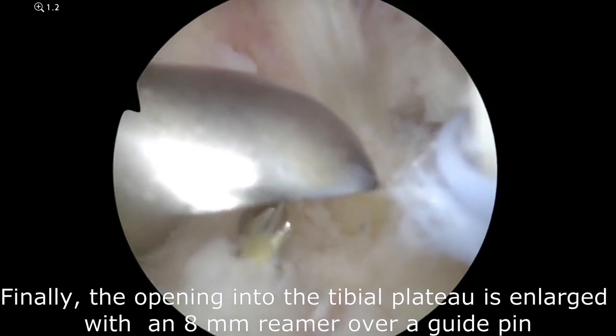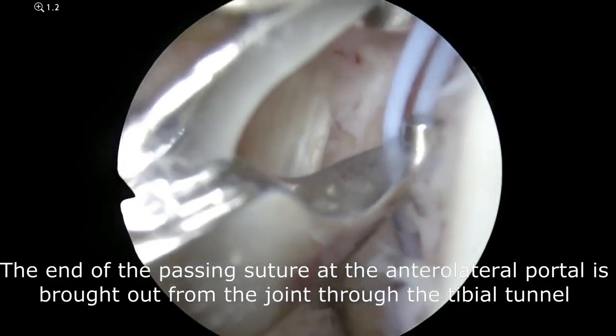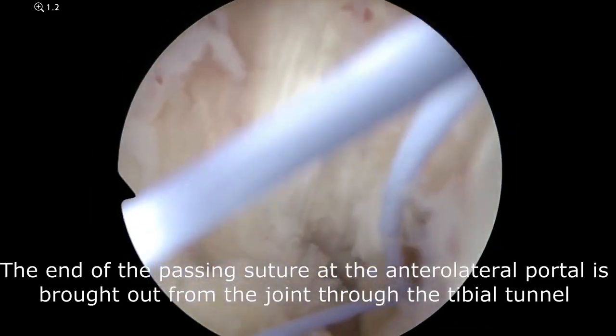Finally, the opening into the tibial plateau is enlarged with an 8 mm reamer over a guide pin. The end of the passing suture is brought out through the tibial tunnel.